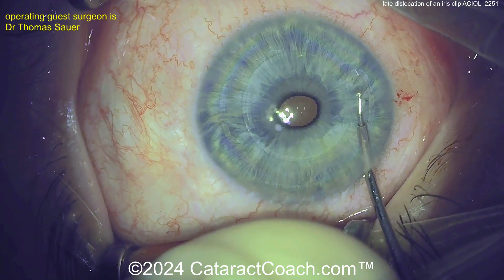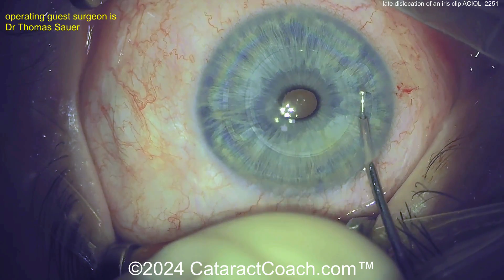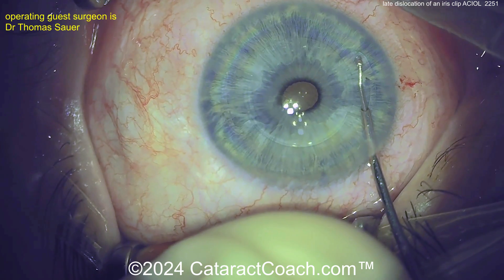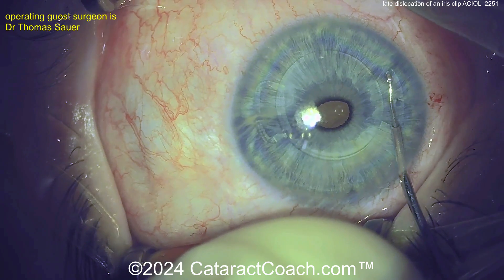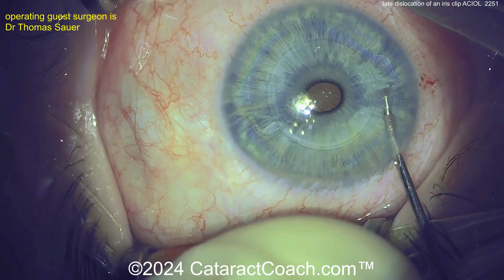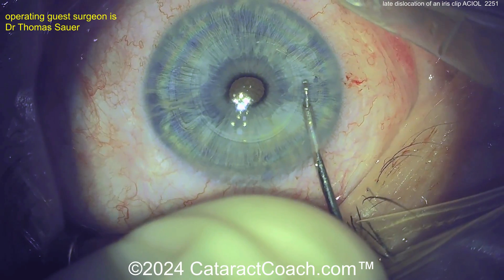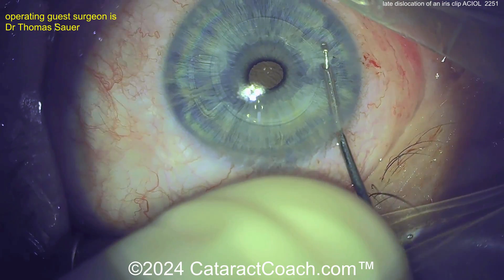Putting it inside there — look at that, you can push apart the claw. I'd use my left hand to push it apart, and with my right hand, get some iris tissue and put it inside that claw. Or you can just do it one-handed like this. Pretty neat. Good thing you had it on your tray — it made life much easier.